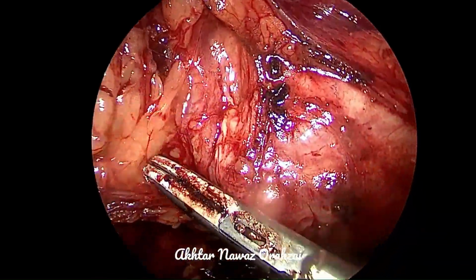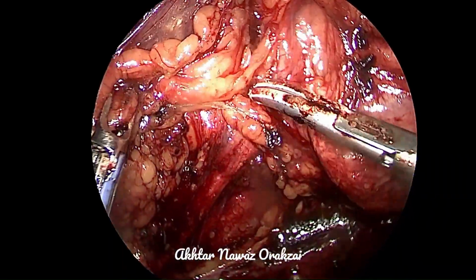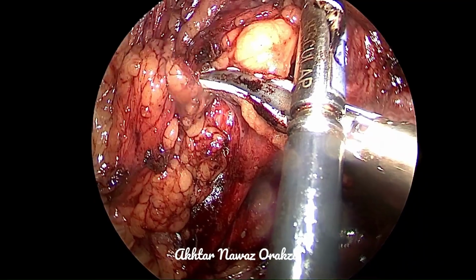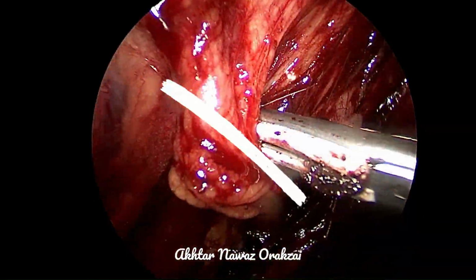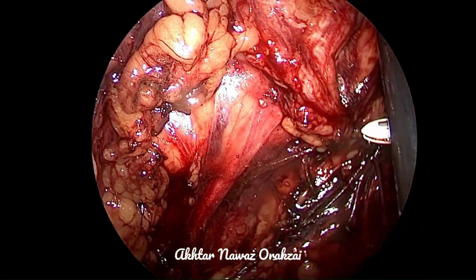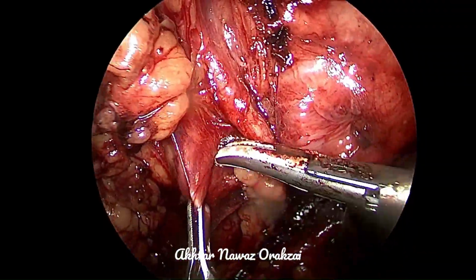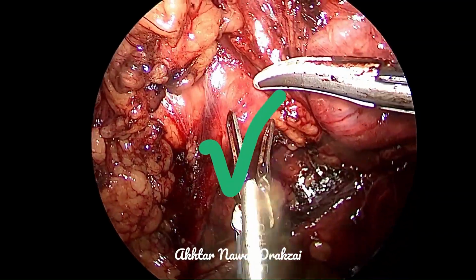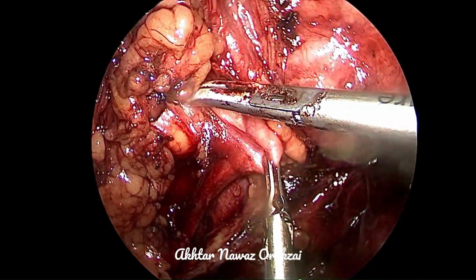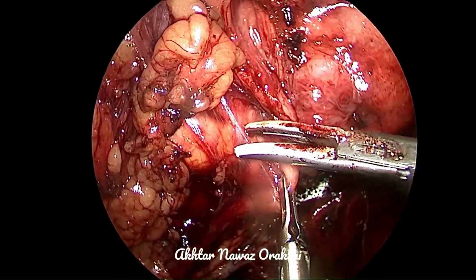The main principle here, when there is an external compression by the vessel, is that you have to dissect the ureter away from the vessels rather than dissecting the vessels away from the ureter, because doing it like this is highly unacceptable; one can easily injure the vessel. However, the ideal position is this. But this is the correct way. Do not disturb the vessels and try to steer the adhesive tissue away from the wall of the ureter.